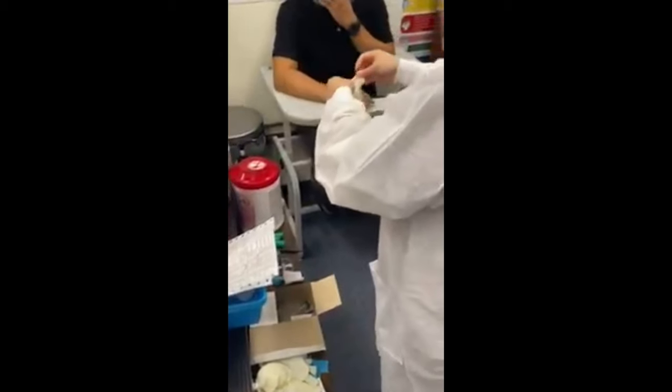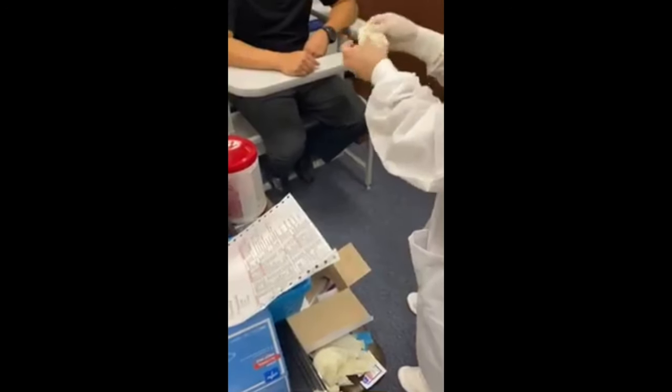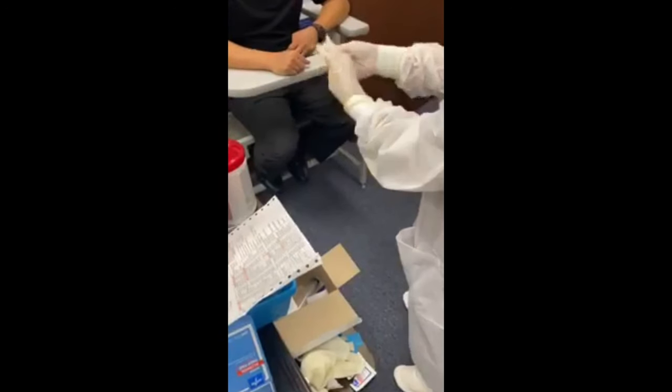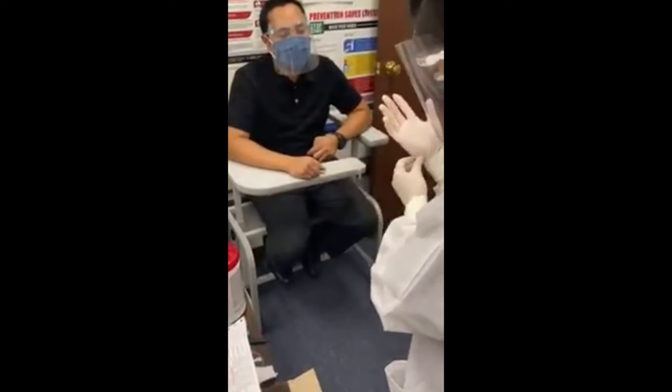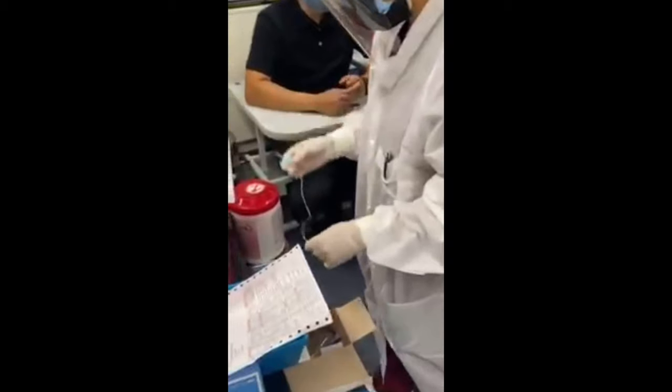Okay, since I had to touch equipment, I'm going to change my gloves again. Yeah, you can. If we assemble our equipment, do we have to wear gloves? That part, you don't have to, but in front of the patient, it's better. Sanitation reasons? Yeah, I would, because some techs, they don't. But for me, since I'm touching it, since it's sterile, I want to keep it sterile. You can touch it without gloves, as long as you hand sanitize, that's fine. But I normally use it with gloves.